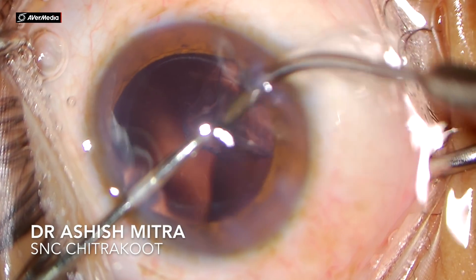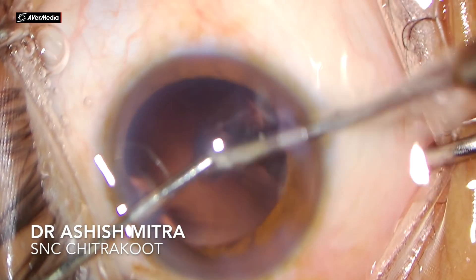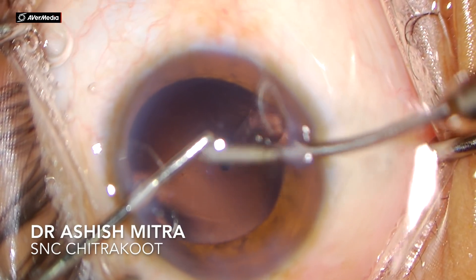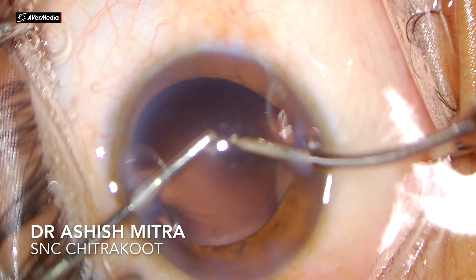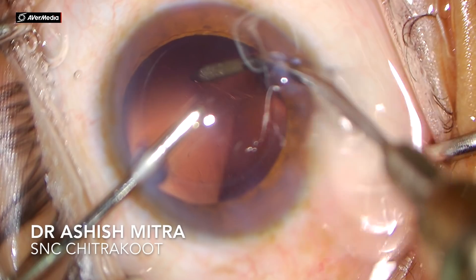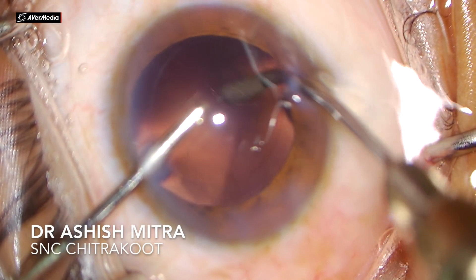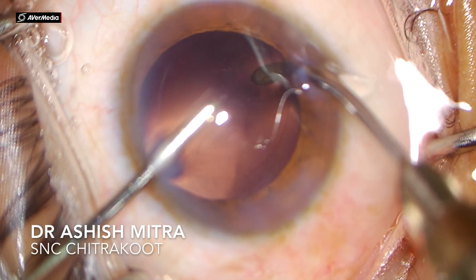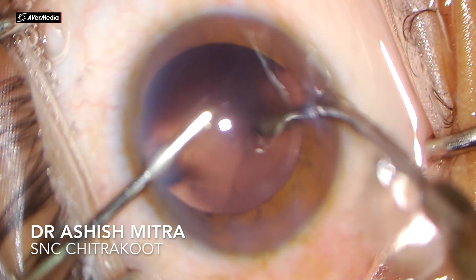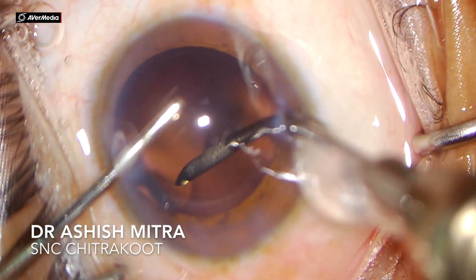Peel it towards the center and then aspirate. In case you feel any resistance, you may be holding the capsule — hold on for a while and check whether it is the cortex or the capsule. If you follow these steps your irrigation and aspiration will be very easy. If you find some remnants still attached to the capsule, go to polishing mode and gently polish the capsule with vacuum 10 and aspiration 10. This will remove remnants that can be a source of posterior capsular opacification later on.